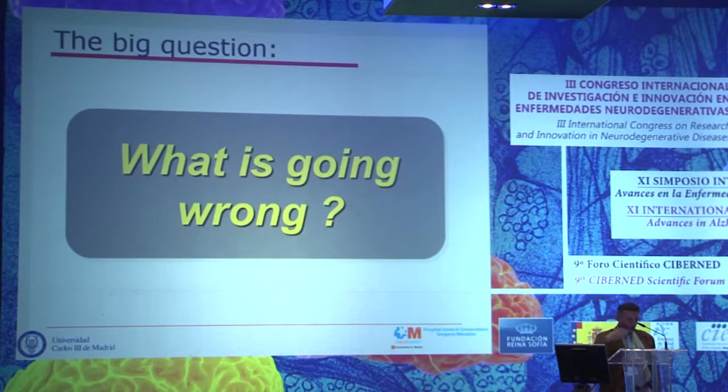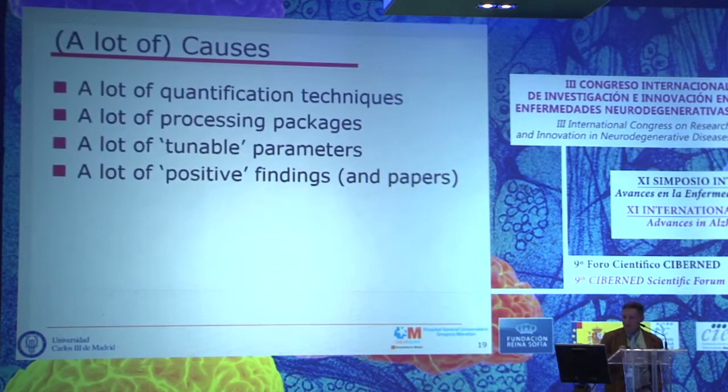So now I'm going to try to explain to you what's going wrong and which ways we have to manage this problem. There are a lot of causes of the problem. As I said before, there are many quantification techniques grouped into many different packages, and none of them is the good one. According to the authors, their package is the good one, of course, and it's not clear for the rest of the world which is better, and the number of packages increases over time.